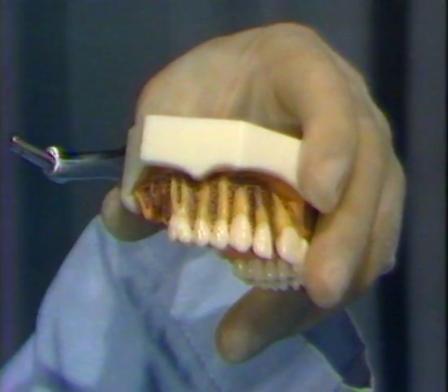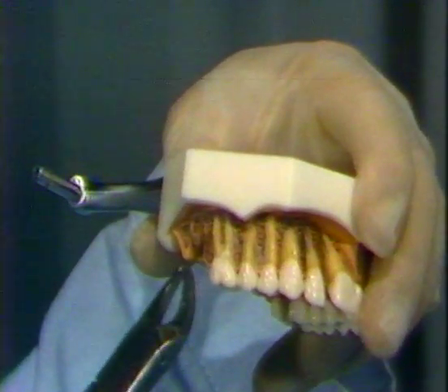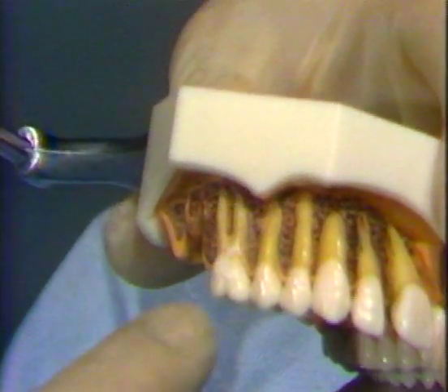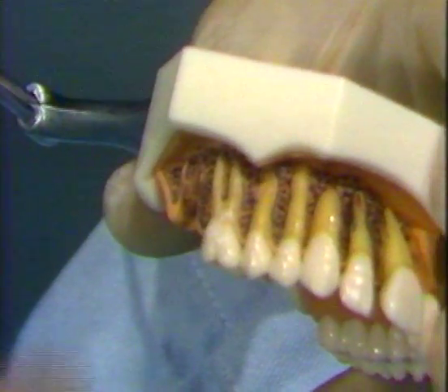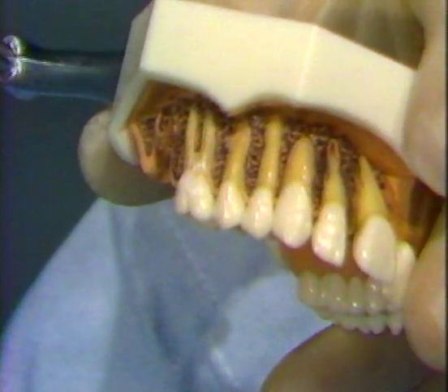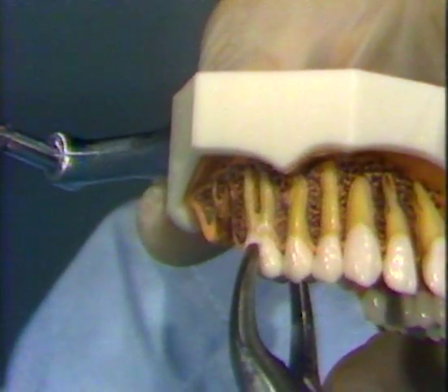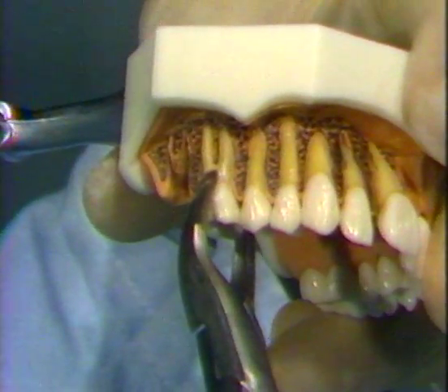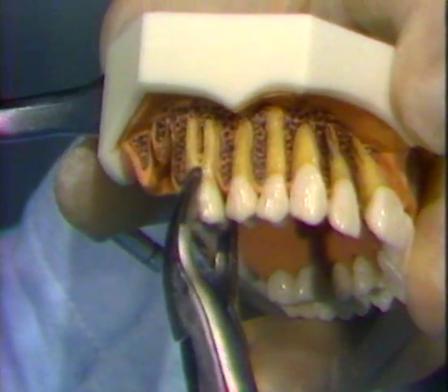For the maxillary first molar, the application of force is the same as with the second molar. However, a little more force is required on this tooth because it is normally a larger and stronger tooth and is located in an area of the maxilla where the bone is thicker and more firm. Remember, excessive pressure and rotating movements on multi-rooted teeth will, in most instances, fracture them. Place just enough pressure so that you can feel the tooth moving in the alveolar socket.